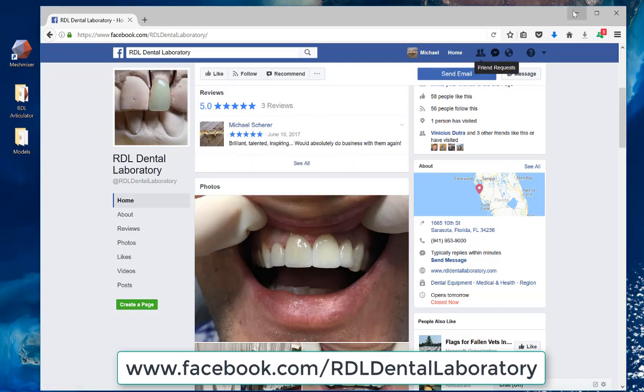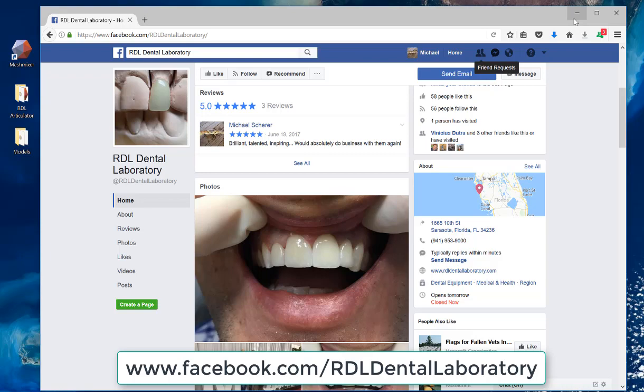A person reached out to me on Facebook, and this was a really cool idea. His name is Seth Reichenbach. He is a co-owner of a dental laboratory in Sarasota, Florida. The laboratory's name is RDL Dental Laboratory. He came up to me with the idea, and he says, I've been playing around with this idea of giving my doctor accounts these digital models using dental model resin from Formlabs, and I don't want to send them my fancy articulator that I use in my dental systems or my ExoCAD software to print.